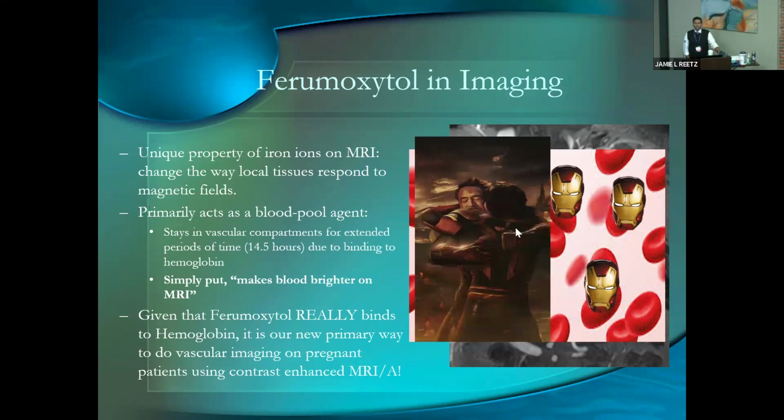And again, I'm going to harp on this because I get this question all the time. Why can't I give ferumoxytol to a patient who has a tumor? Or why can't I do that? Well, this is the ferumoxytol. This is the hemoglobin. They really love each other. They hang out, and they do not really separate from one another that much. And so really remember that ferumoxytol is a vascular agent.